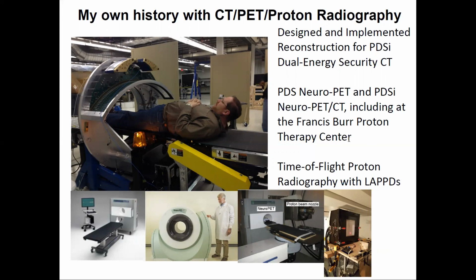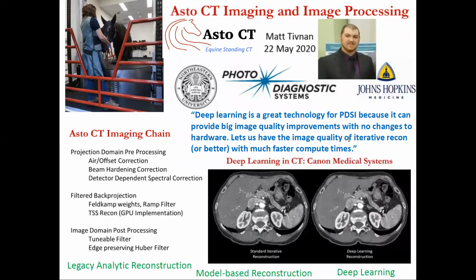They went through making security CTs. They've got some other stuff I'm going to show on the next slide. I've made CTs and PET-CTs, portable PET-CTs with those guys. And now I had help, given that deep learning has arrived, and I'm not in the CT field right now. I'm in PET and also in instrumentation and photosensors and stuff like that, the detectors.